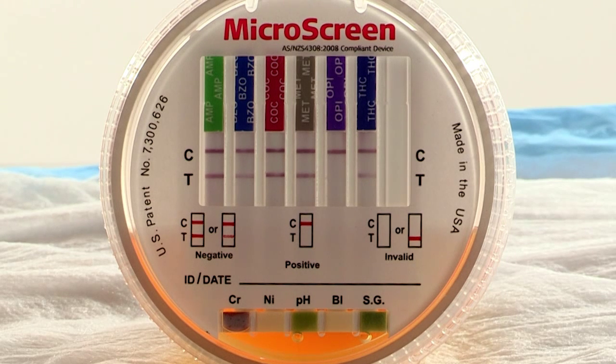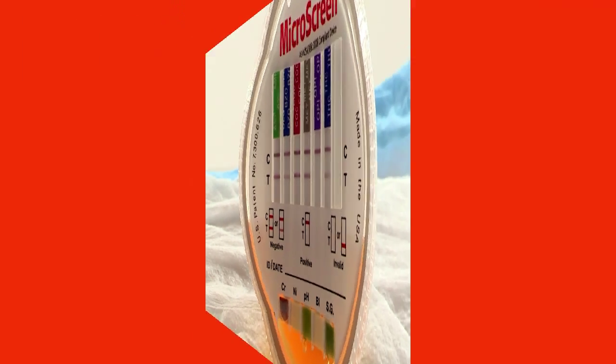And if a colour is abnormal, that means that the laboratory will be asked to check for the abnormality, and that person will be required to stay around, supervised, until they can provide another specimen, and the second specimen would also be sent to the laboratory for further checking. The results of the tests will be recorded on the chain of custody form.